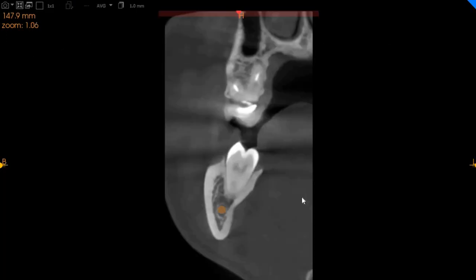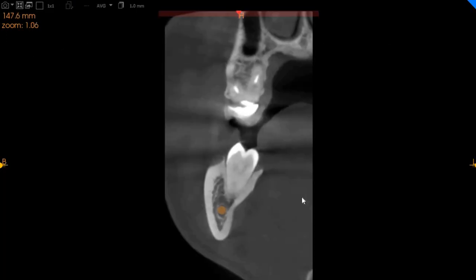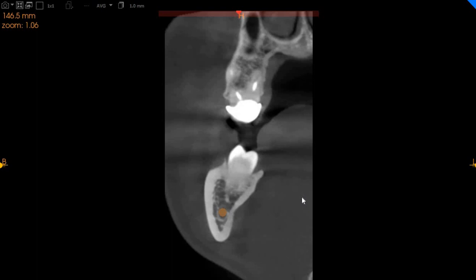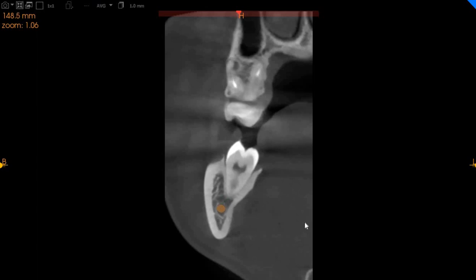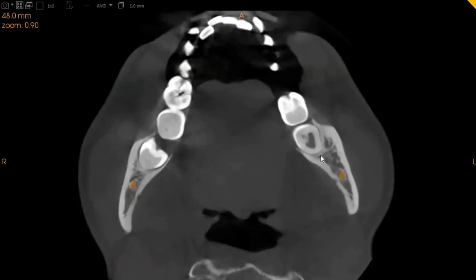This is the transaxial view. Here you can see that this is the mesial root of the tooth, and this mesial root is approximately 2.5 millimeters away from the nerve. So hence the lower left eight should be absolutely no problem in extracting.